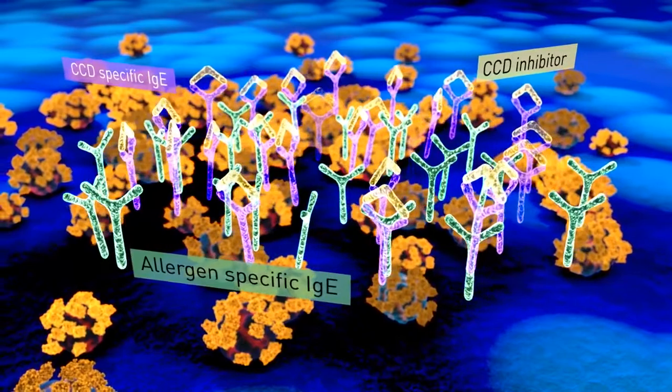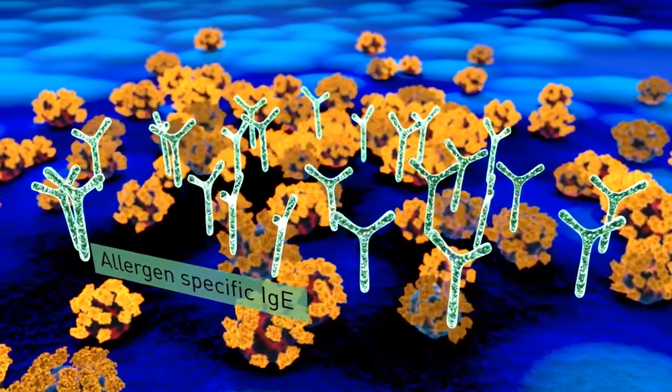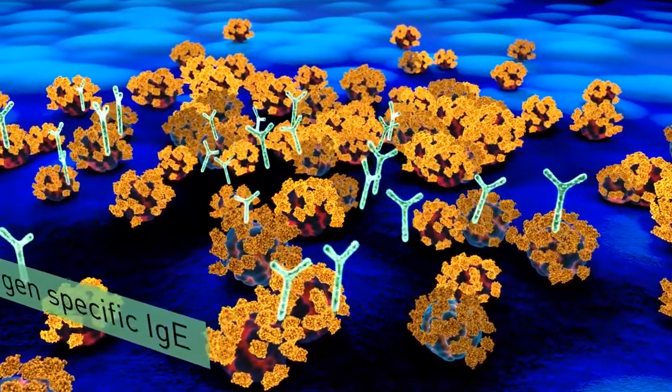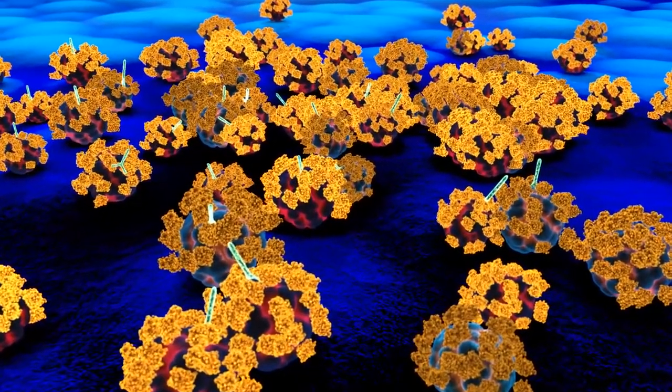Before the Allergy EXplorer is performed, the inhibitor will block CCD-specific antibodies, and only the protein-specific IgEs that remain in the patient's serum will be detected. This results in the measurement of only the allergen-specific antibodies, which will facilitate the interpretation of your patient's test results.